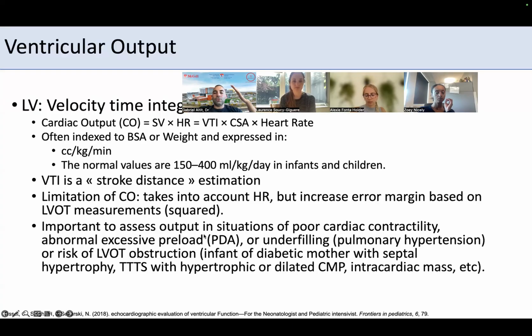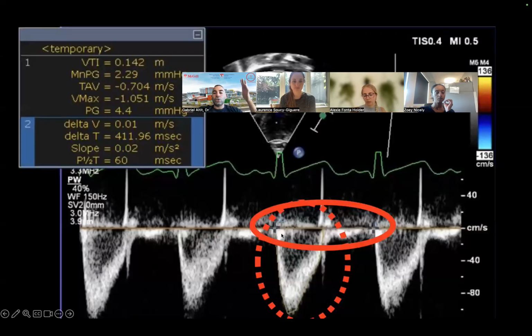In dehydrated syndromes, you will see that this curve becomes much more, the systolic duration of your ejection is much shorter. So you get almost like a blip, boom, like this. It really goes back to your baseline very quickly because your LV walls are kissing and they're not able to eject that much, and the time they spend in effective ejection starts decreasing.